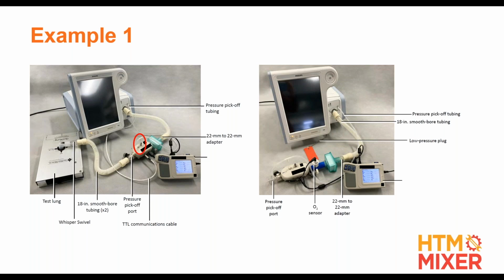Like, for example, you might not see that there's pressure that has to be teed in right here. On their other screen here, you might see that the oxygen sensor has been put in place. So there are some things that are still missing here. And the biggest problem with this is they've shown you one analyzer. They chose this analyzer because it was popular at the time, and so they put it in their service manual. And if you don't have this analyzer, now you have to kind of figure out, how do I substitute my analyzer for this one?